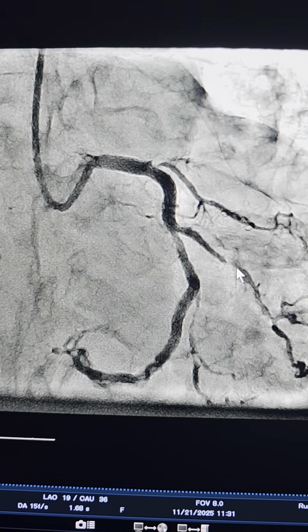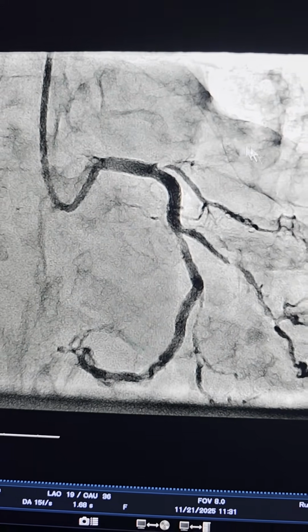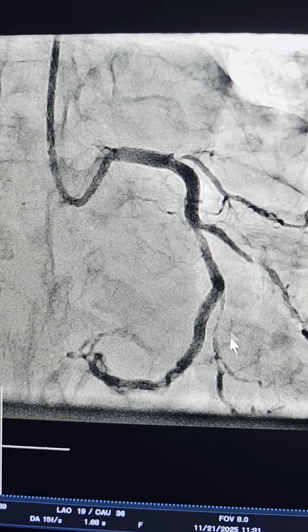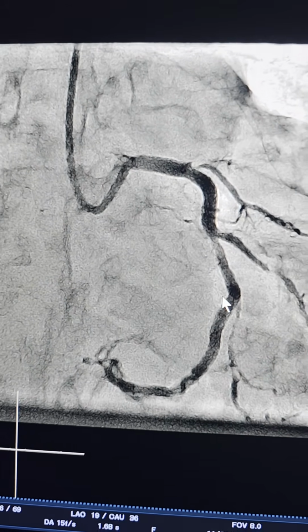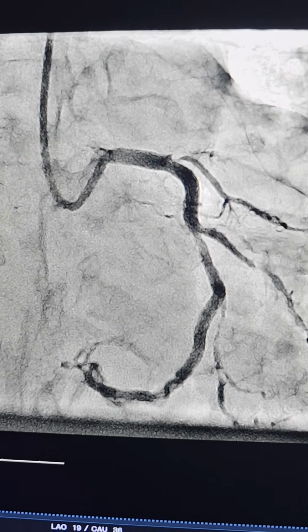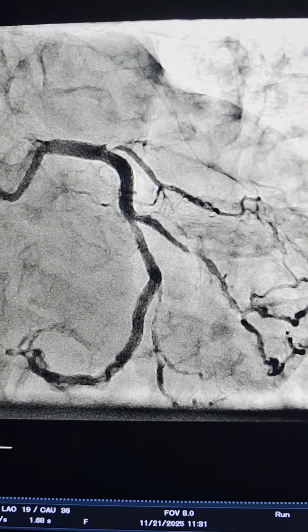and then he underwent a thallium scan which showed a large area of ischemia in the anterior wall. So obviously he's got a left dominant system, the right is non-dominant and filling the LAD from the right side, as we will see later. So this is his angioplasty.